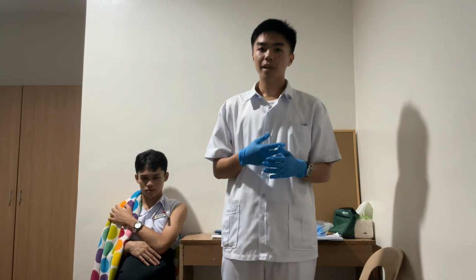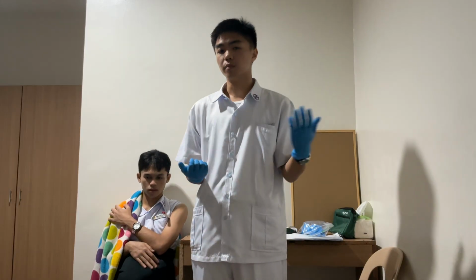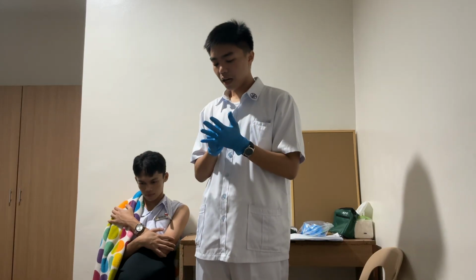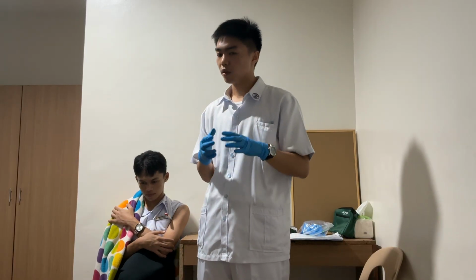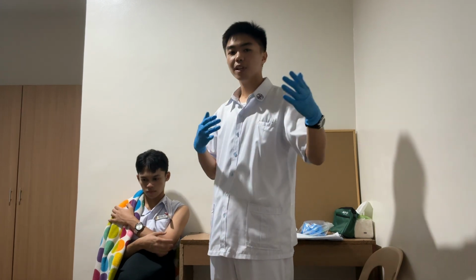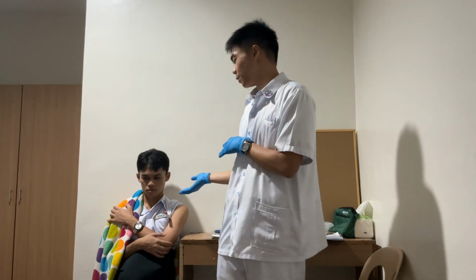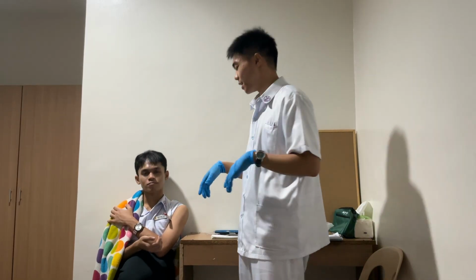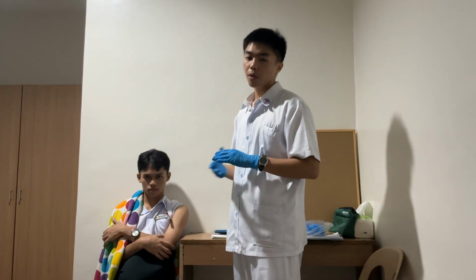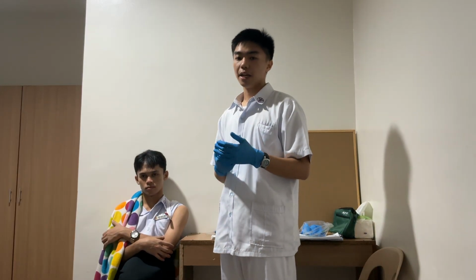So, in an ideal setting, we can already take the respiratory rate and the pulse rate together with the thermometer, so as not to waste time if we are catching up with time. But since this is a return demonstration, we want to optimally show the step-by-step procedures, then ideally din to yield accurate results, we have to do it one by one, lalo na if this is your first time. So, assuming this is my first time and this is a proper return demonstration, then we just have to wait until the thermometer makes the sound or indicates that the taking of the temperature is already done.